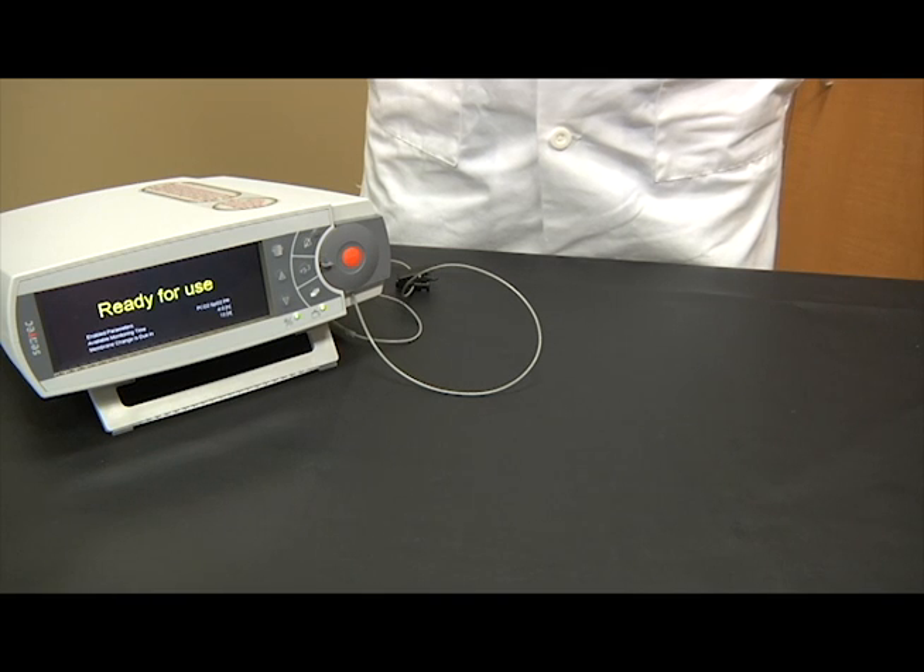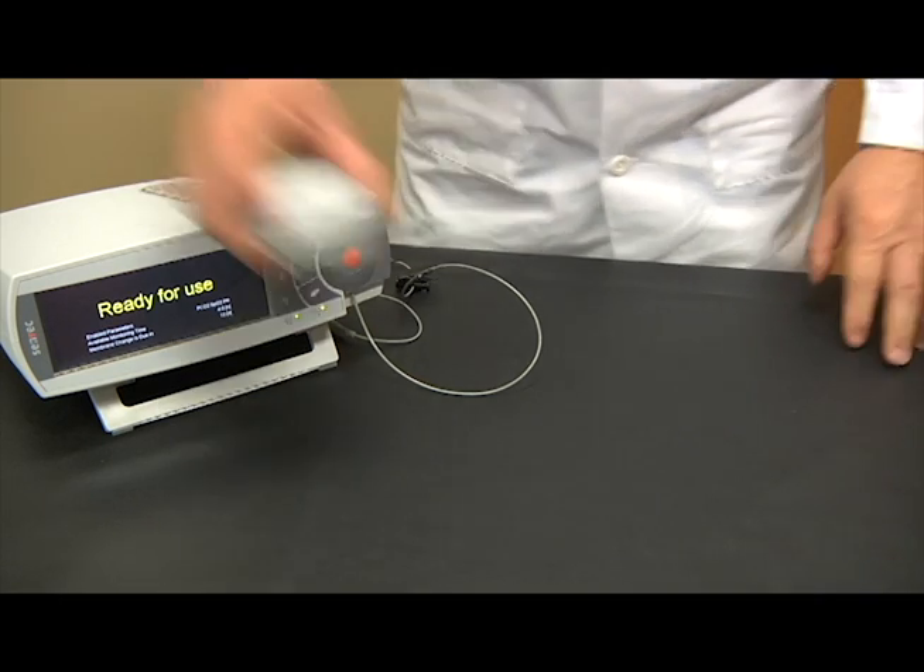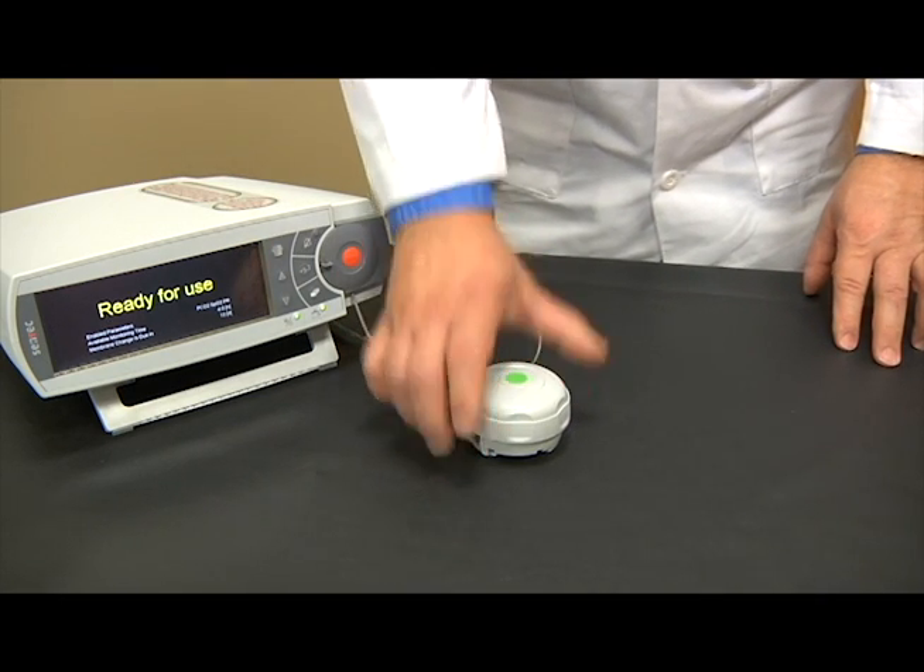To successfully accomplish these tasks, please follow these four simple steps. Step 1: Place the membrane changer on a smooth, stable surface, green dot facing up.